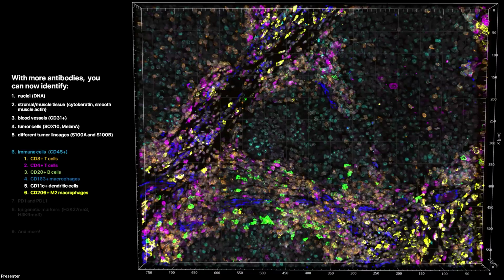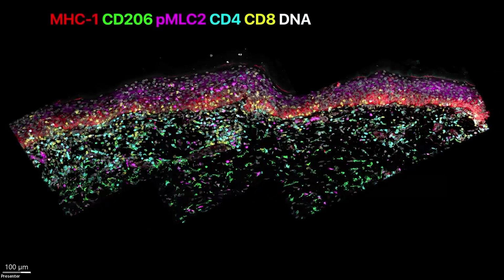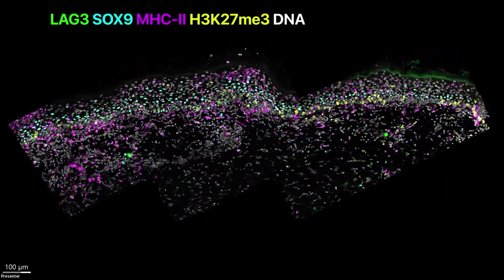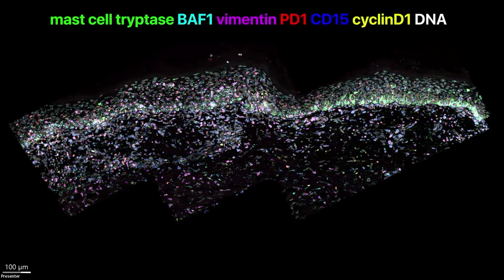We can routinely do 100 markers on most samples now by also staining for antibodies specific for extracellular matrix, epigenetic marks, cytokines, and DNA damage. And using CyCIF, this can be done on a batch of 50 to 100 traditionally cut 5-micron tissue sections, if imaging in 2D.